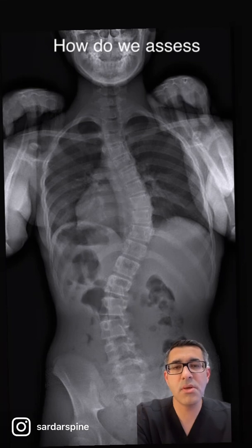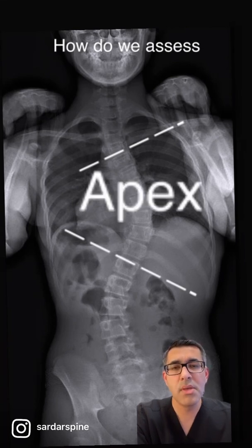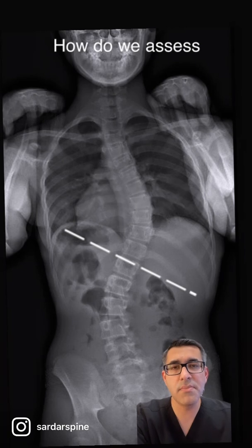Next, we measure something called the Cobb angle for each of these curves, which is measured from the most tilted segment above and below the apex of the curve.